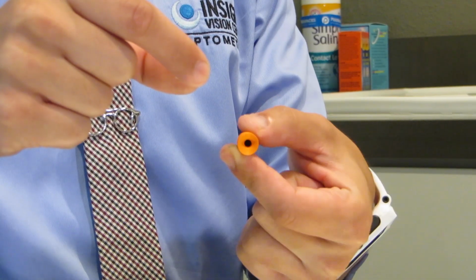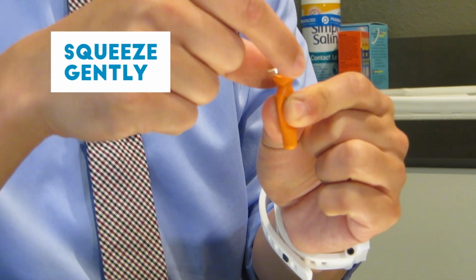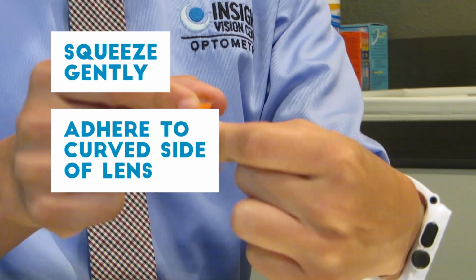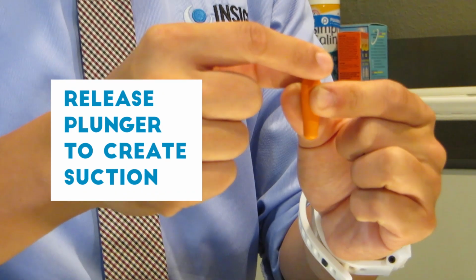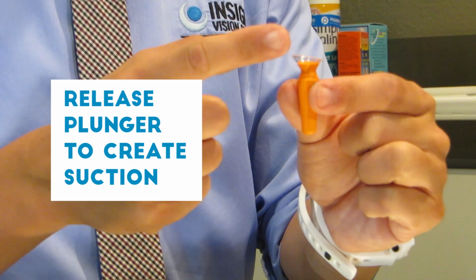Step 4. Using the DMV insertion plunger, squeeze gently to remove the air and then adhere it to the curved side of the contact lens. Release the plunger to create a suction. Check the seal of the lens to make sure it is on the plunger securely.